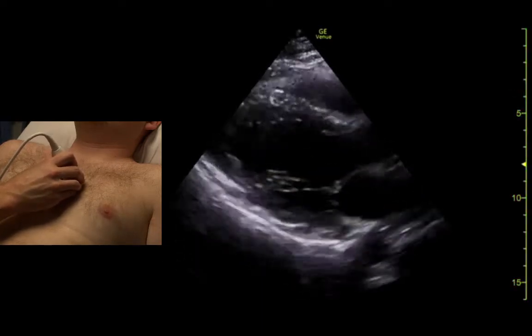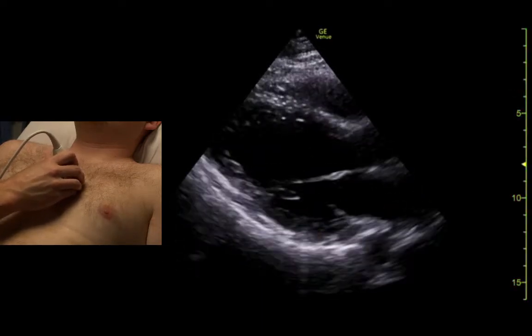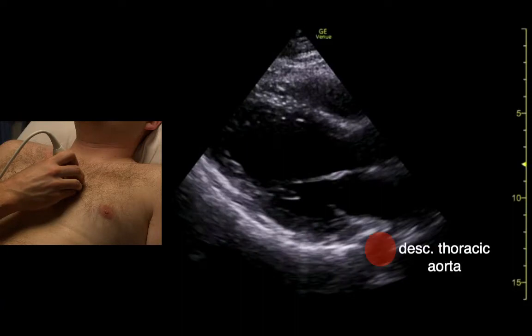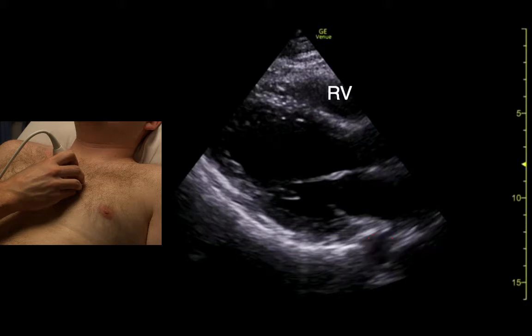There's the descending aorta back here. Right ventricle is up here.